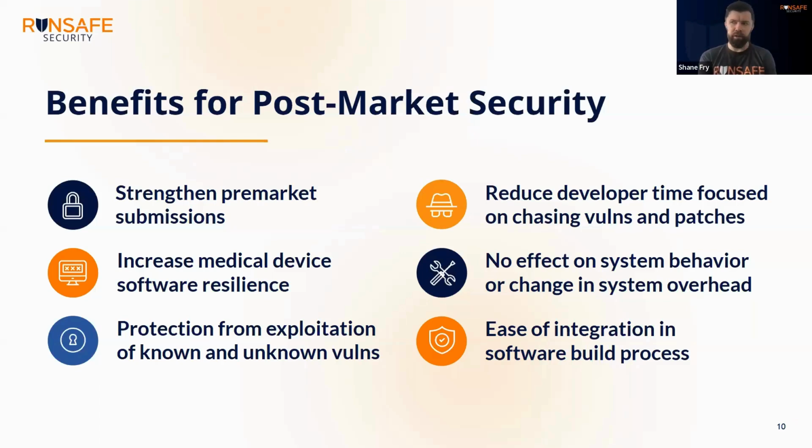We were too. But if you don't know what software you have in the device that you're shipping, you're going to be at a place where you can't effectively know what your risk posture is. From a pre- and post-market perspective, you don't have a way of knowing what the vulnerabilities are, and then you're caught flat-footed when somebody like Armis or IOActive or any number of security research organizations come out and say, hey, look, we've got all these vulnerabilities we need you to patch. Okay, well, that's good.